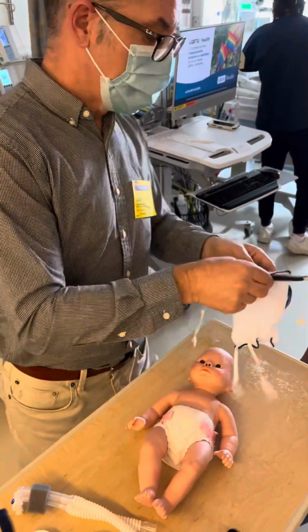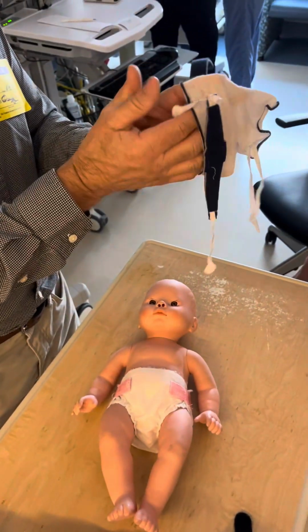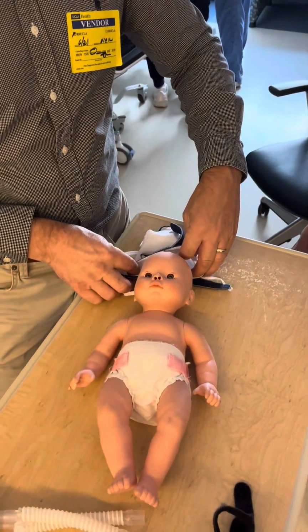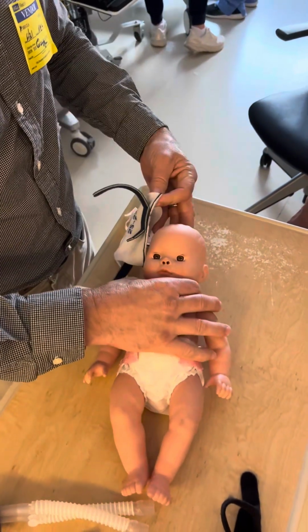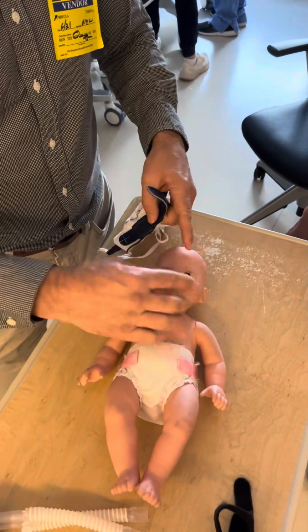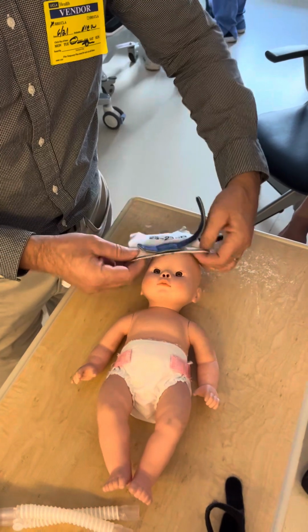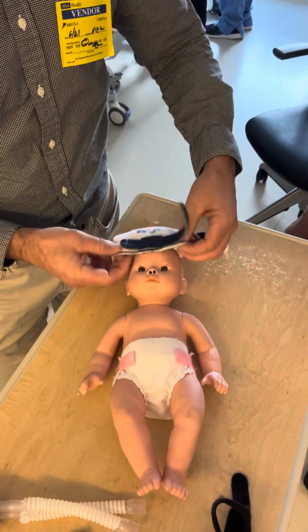So what you're going to do is take the bonnet, open it all the way up, give it a nice stretch. A lot of times what RTs do is they start at the base and bring this up like that. The nurse kind of raises the baby into the air. The problem with that is we actually want this rectangle placed in between the eyes of the baby, centered. So you see it come up, and a lot of times it looks like that, and then you've got to spin it over here, and it can be very challenging.